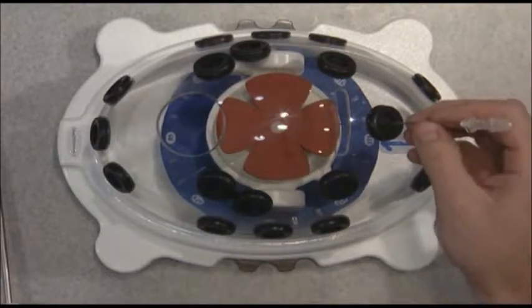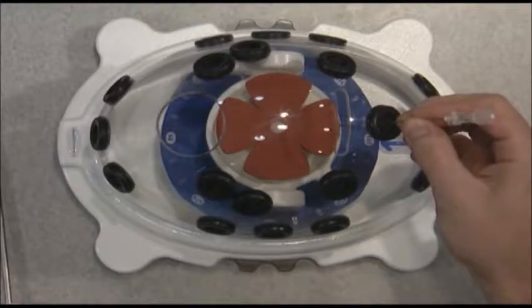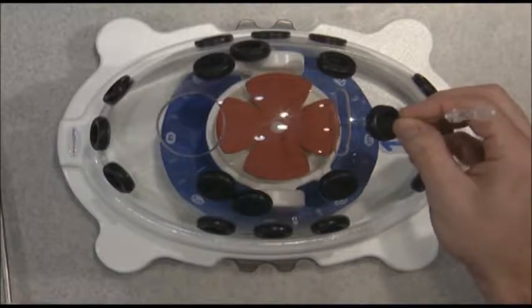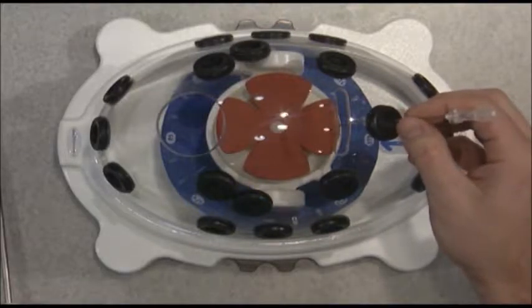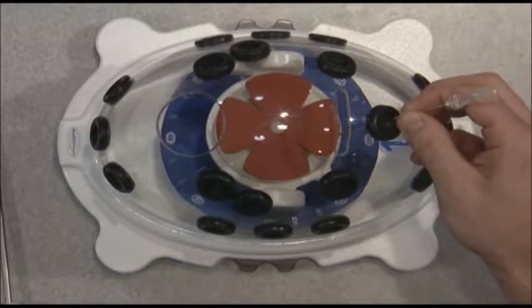I'm going to take a spinal needle and try to optimize placement. And you want to make sure that this comes in at about a 45-degree angle to the puck that we're simulating. And we're going to insert 2 anchors, one anteriorly and then one about a centimeter more posterior to that.